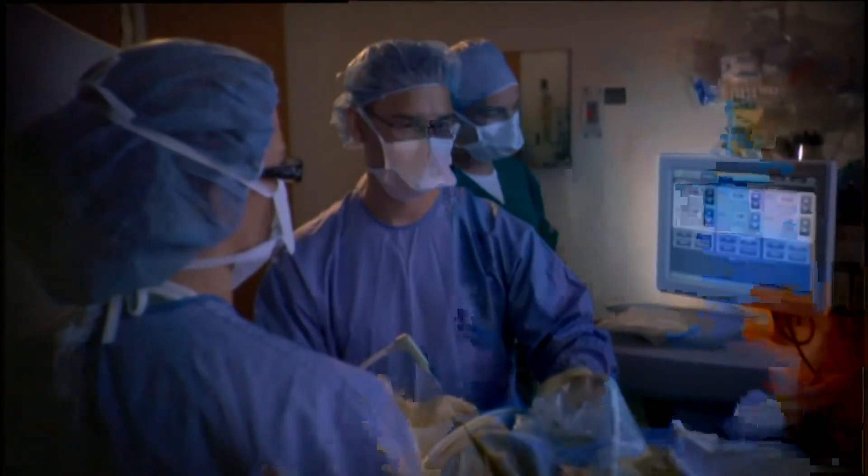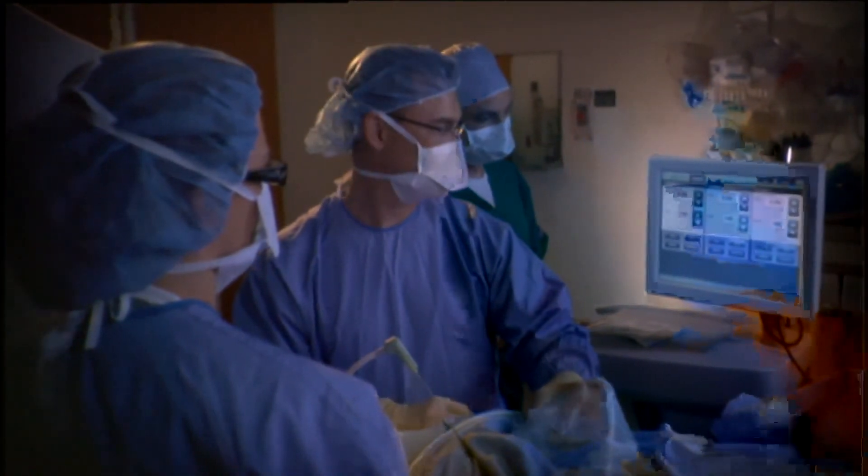The SIRTIS 140 really excites me in terms of development because it's going to be clinically relevant to the physicians. It will enable them to treat a wider range of patients and to do it in a way that's both cost-effective for the healthcare system and frankly more efficient for them than what's available today.